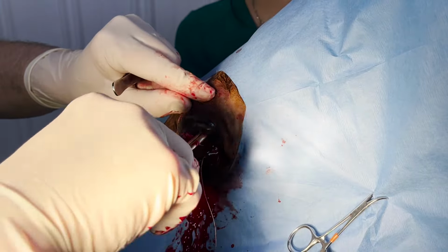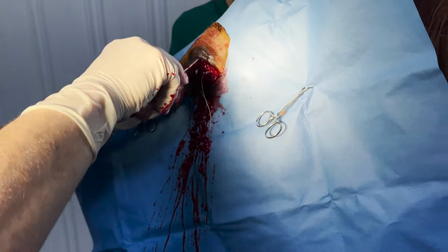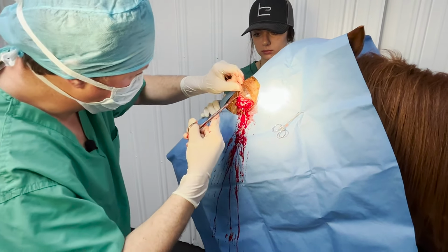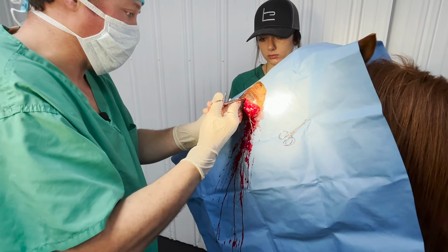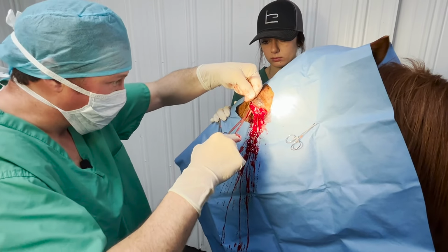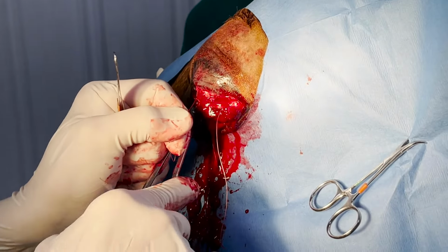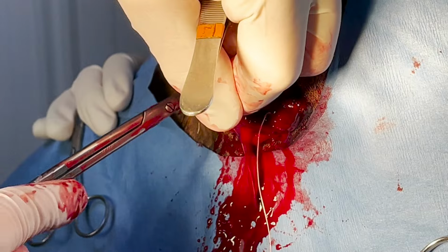Basically. One thing that's always surprising is how large their eye socket is and how big the eyeball and everything is, but that's why they have such a great field of vision too. Everything that's holding this thing in place, the optic nerve will be the last thing we cut. You can see how far those scissors are going back there. I'm staying away from the optic nerve. Hard to block. That'll be the very last thing we do because I want to make sure that the local block we put in there is working.